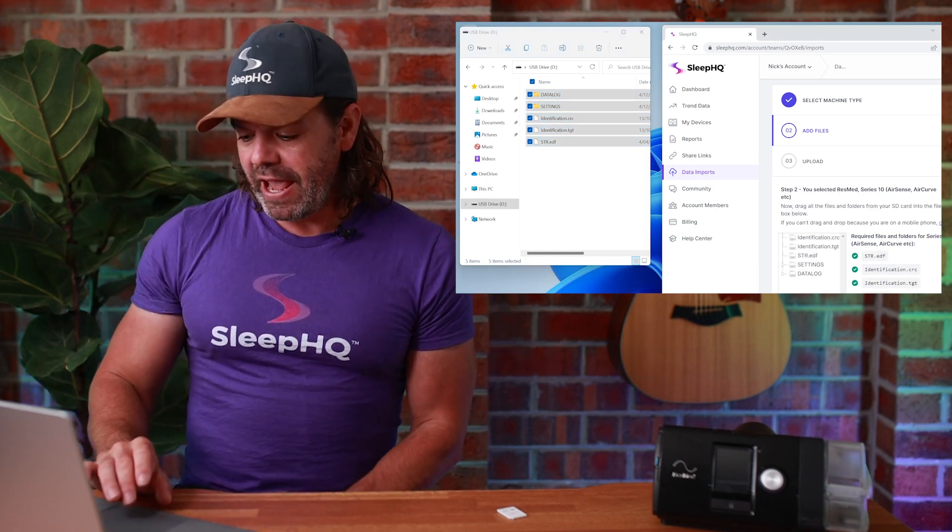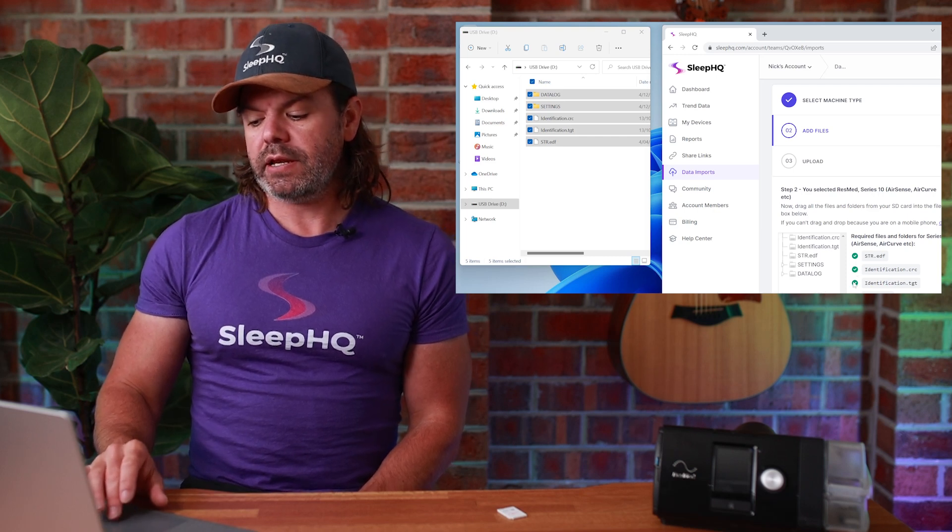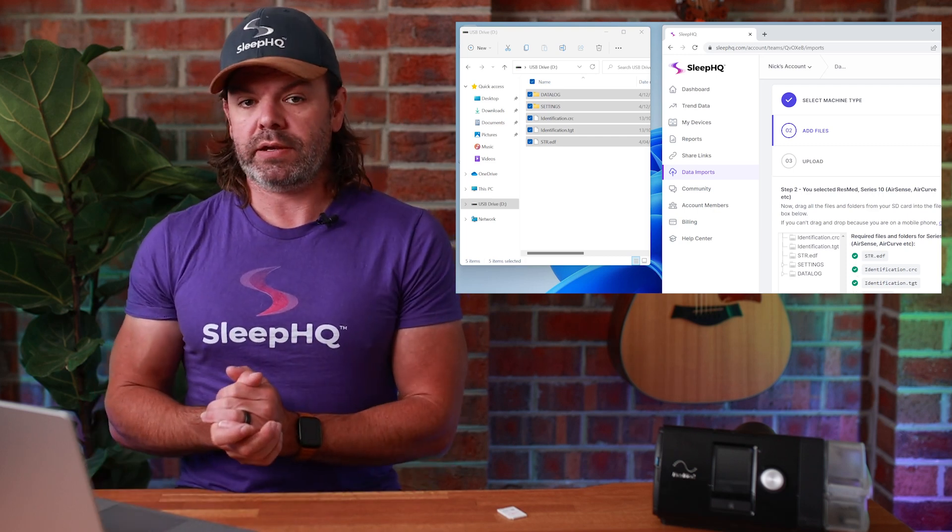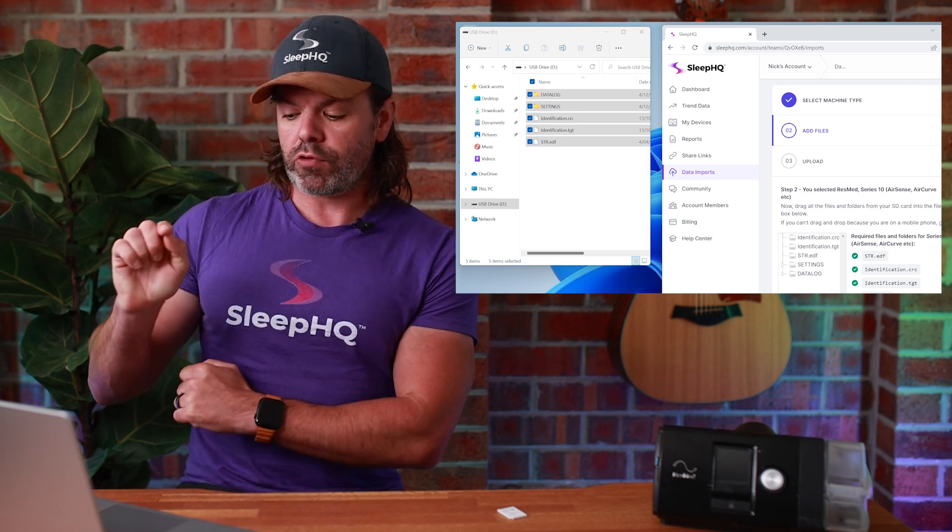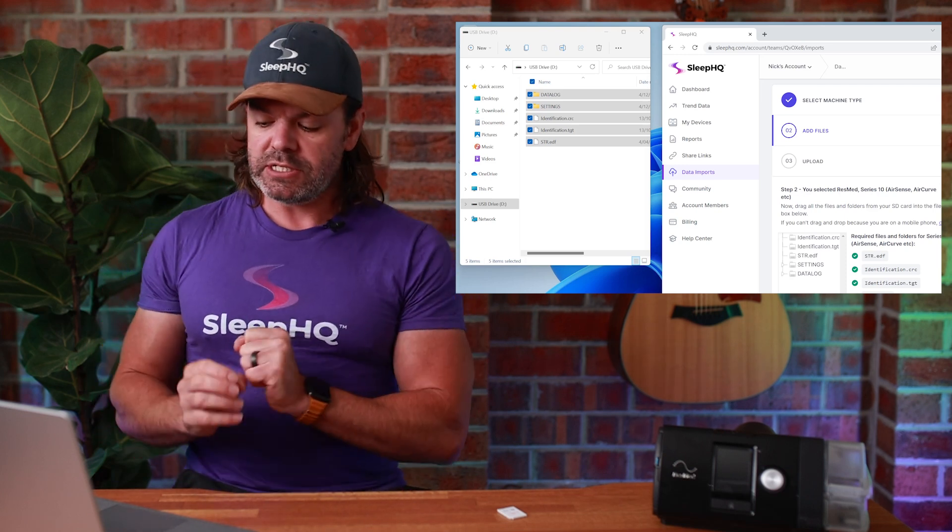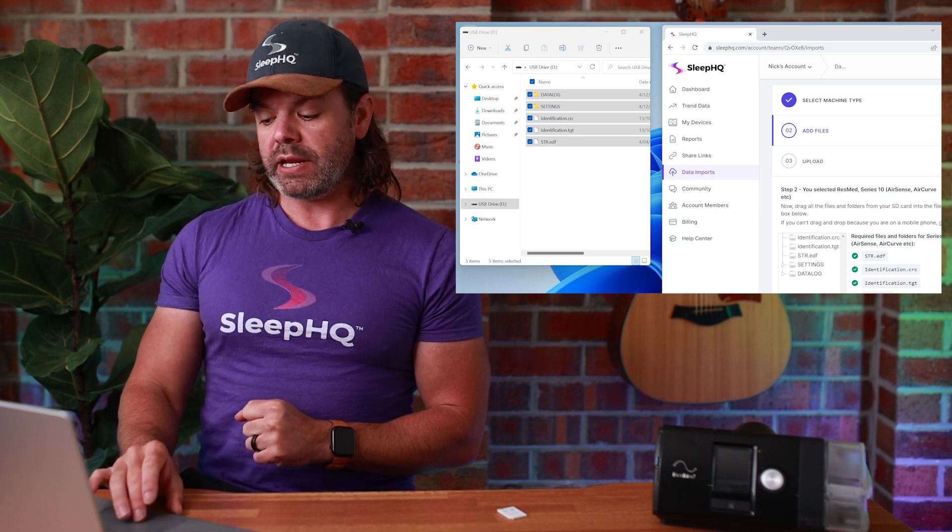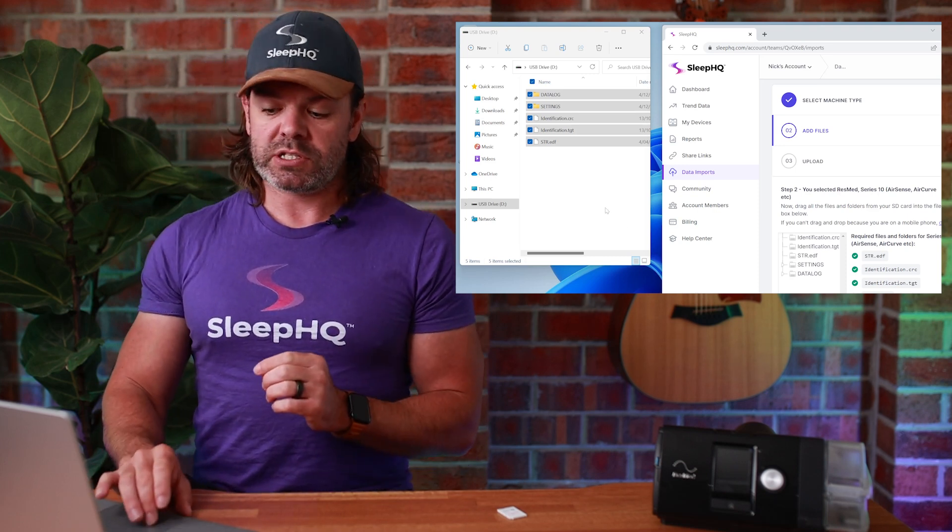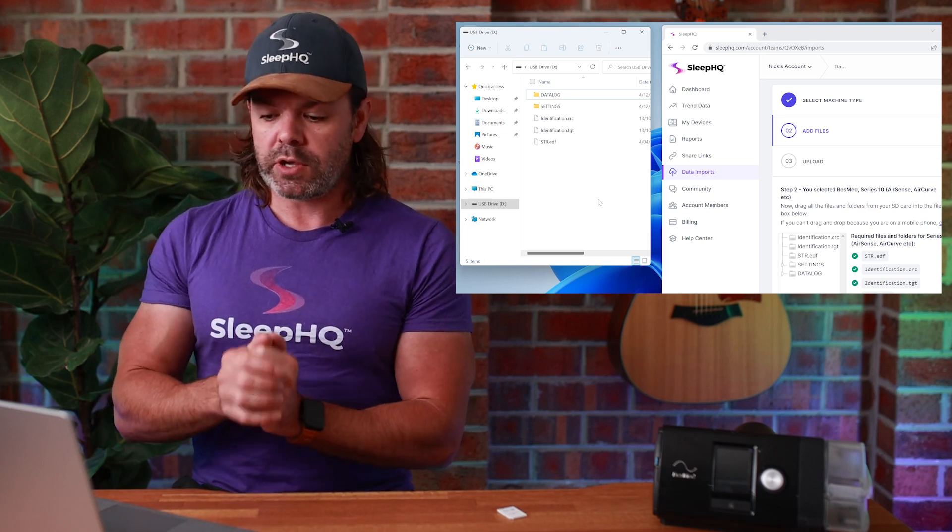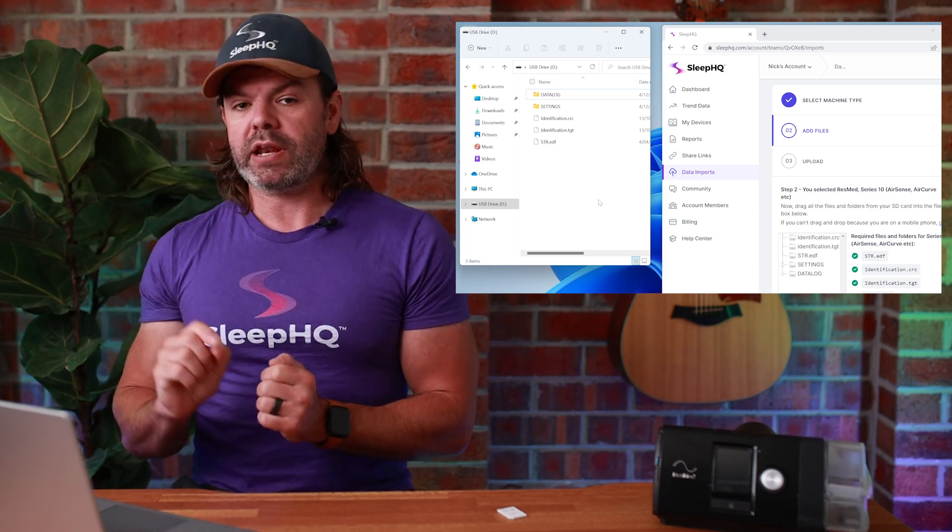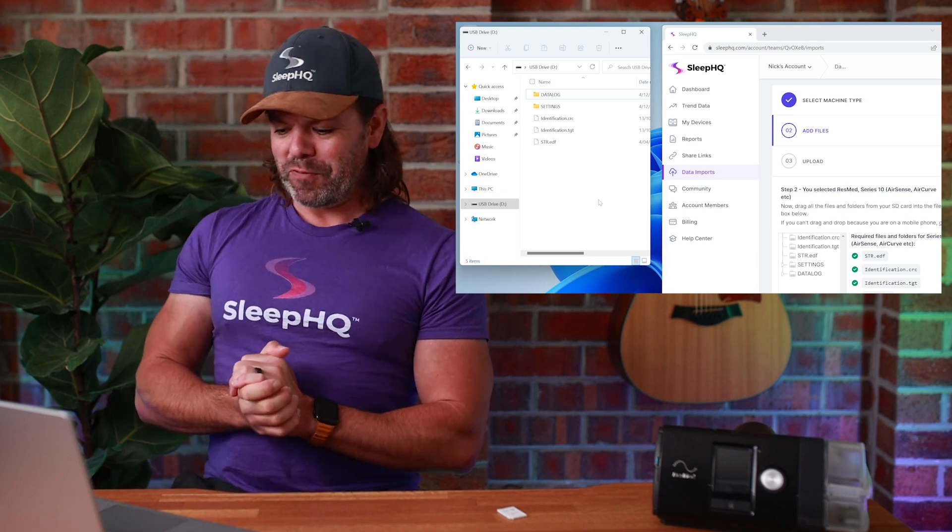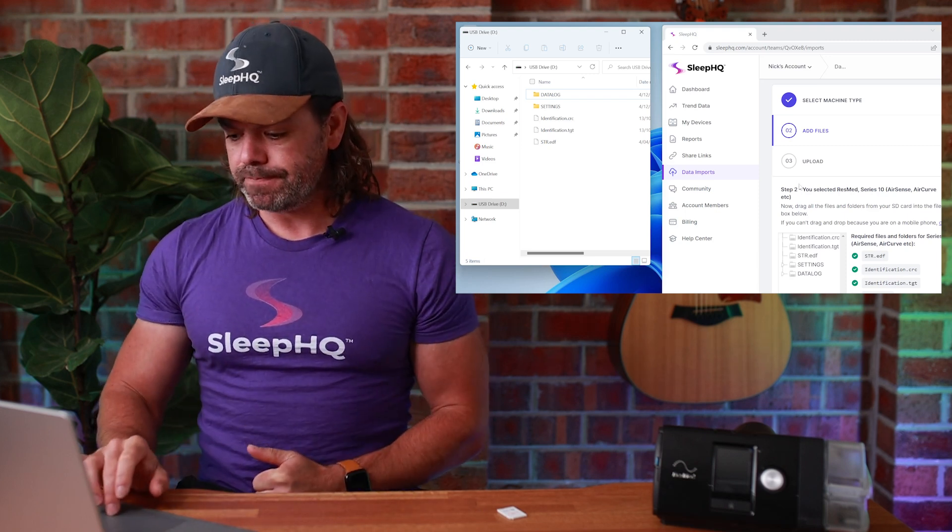Pretty easy, right? And now you can see I have a green tick next to each of the files I dragged in. That's what you want to see. You want to make sure you have a green tick next to each of those files. Let's just say I didn't have a green tick next to the data log folder. There's a chance when I selected all the files, I might have missed one. So just go back, grab whatever one you're missing, bring it in, and make sure you've got one, two, three, four, five green ticks, and then you're good to go.